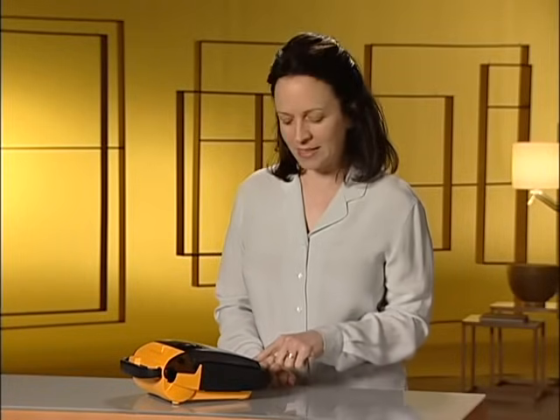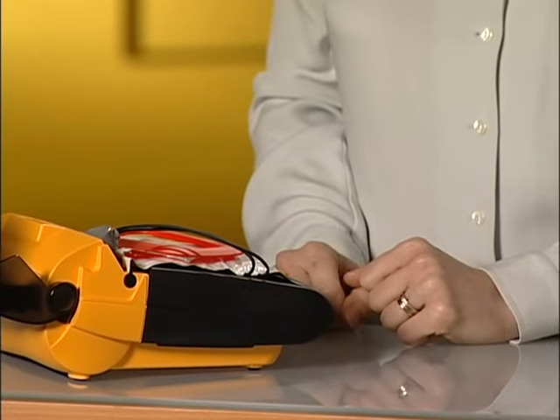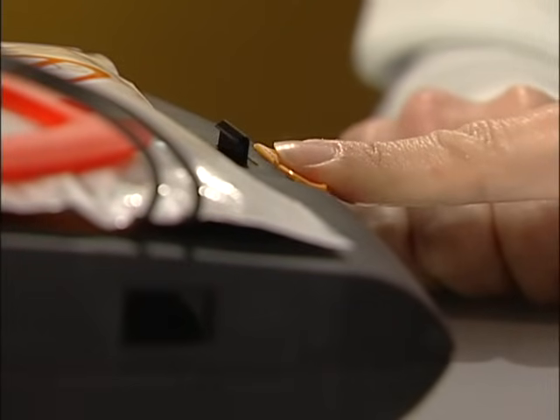Now we'll make sure the speaker is working. Push the lid release button to open and start the AED. You should hear the voice prompts. "Call for help now." Now turn the device off. Hold this button for a few seconds until you hear it turn off. Close the lid, and that's the inspection.